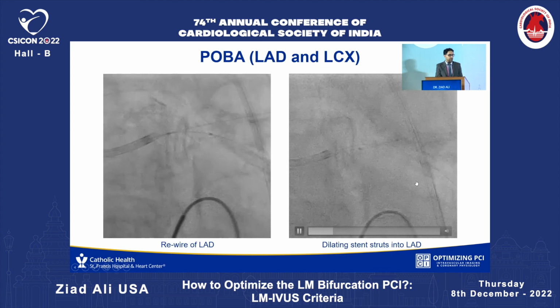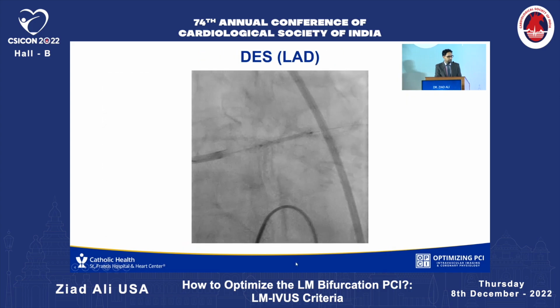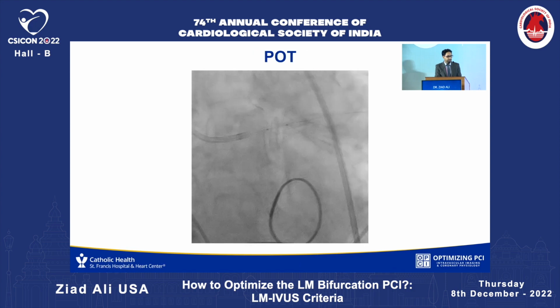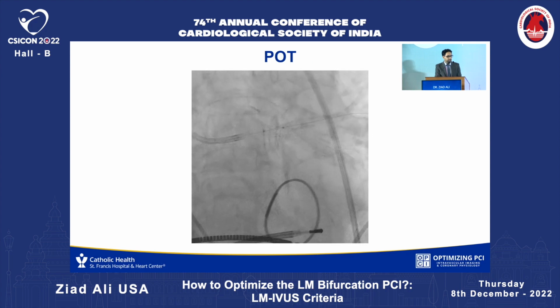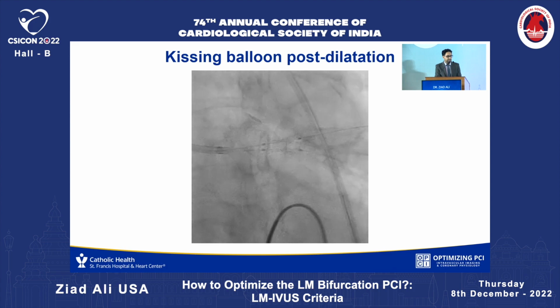Following this, we're doing a standard culotte technique. We perform a balloon dilation. We cross over through the new strut, make some space for ourselves, place our drug-eluting stent, again measured 18 millimeters on either side, recross, perform a proximal optimization technique, and then do kissing balloon inflation.